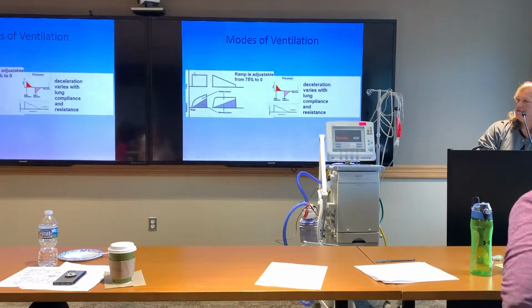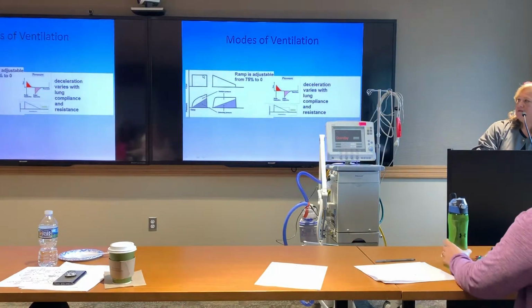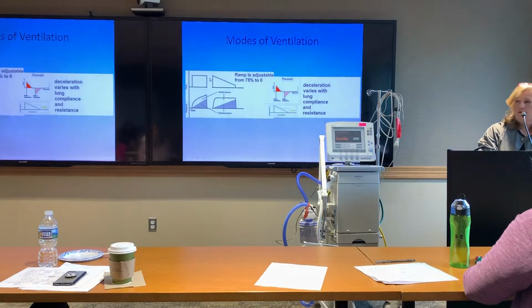You go from nothing to whatever level I've got set, 40, 50, 60, whatever, maintains that level until the tidal volume delivery is done, and then the breath ends, and that's all great, okay? We don't like this one. Nobody likes it. The patients hate it. They're very uncomfortable with it. This one hits a higher flow first because people are air hungry. They want that flow right away. They don't want to wait for it the whole time. They want to just get it.